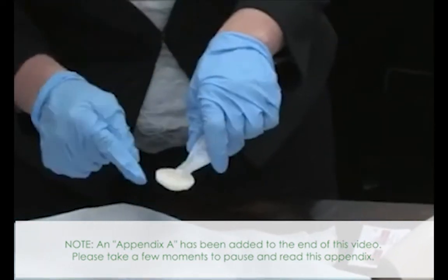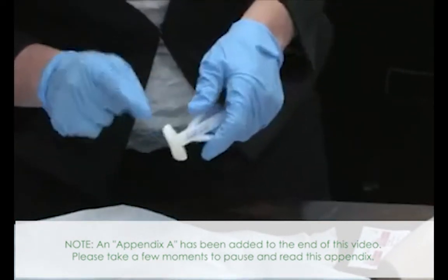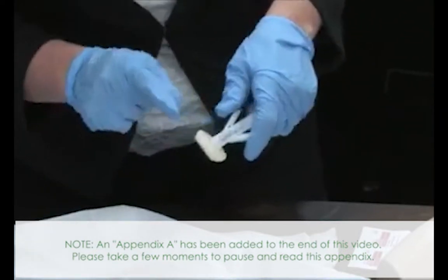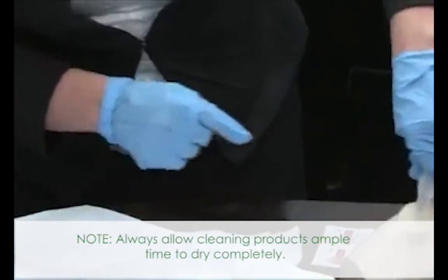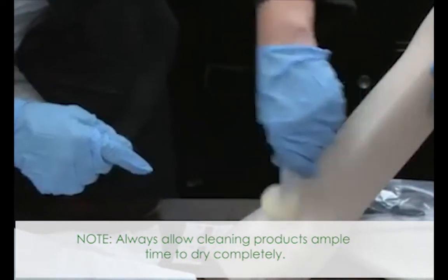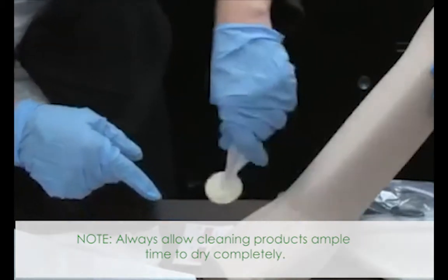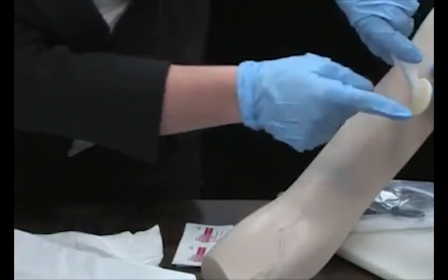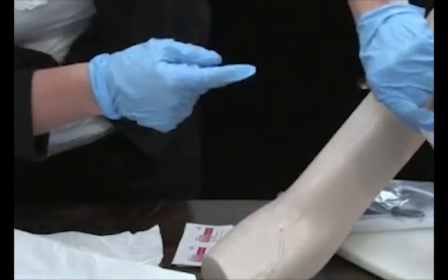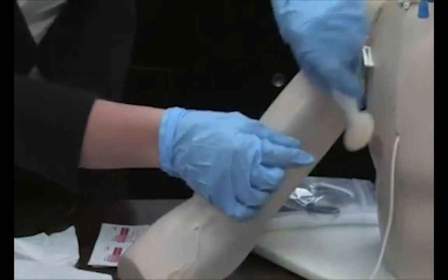This allows the fluid to reach the end here. And the difference between this and alcohol and the iodine is you're able to scrub the area all around, since it's going to clean and disinfect the area. And you can get the catheter, get all around there. If you were doing a chest catheter, then you would do the same thing, and you can even use a gauze to lift up the catheter if need be.